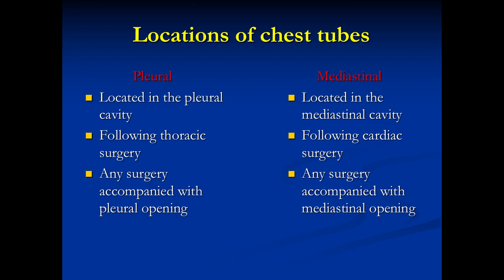Okay. Other location of the chest tubes is in the mediastinum, either in the mediastinal cavity itself anterior to the heart or in the pericardium. So it may be following cardiac surgery or following any surgery accompanied with mediastinal opening, even without opening the pericardium. Okay.